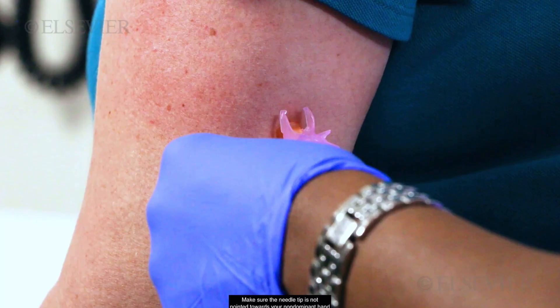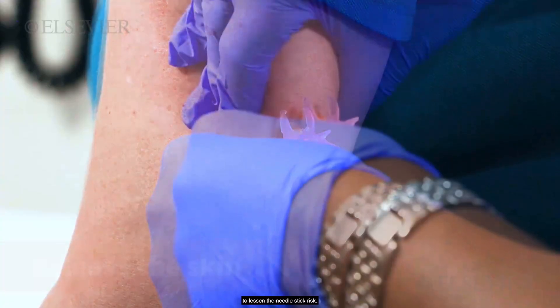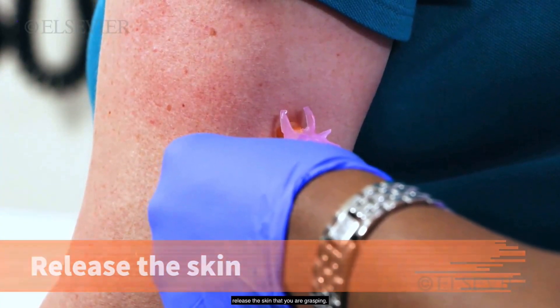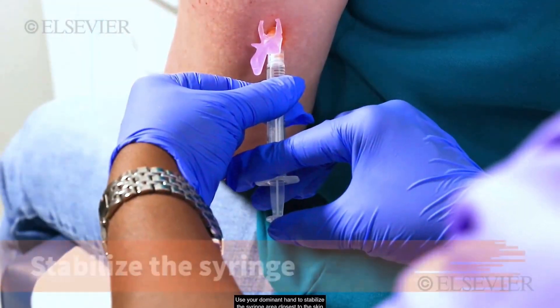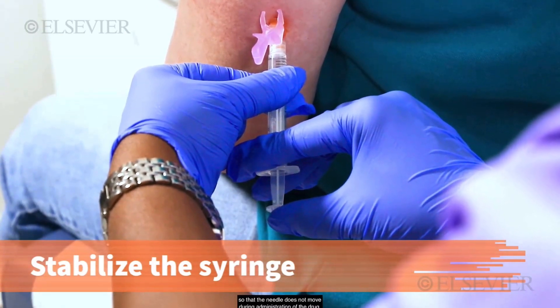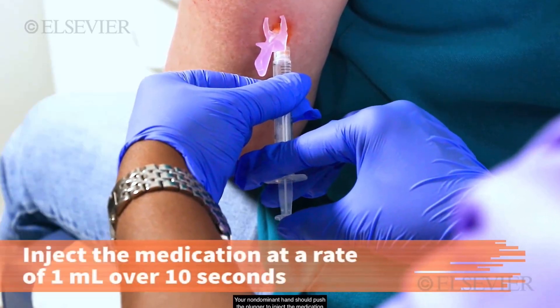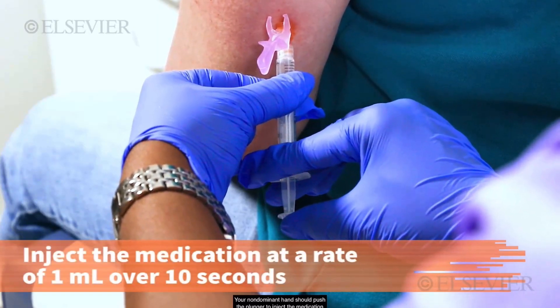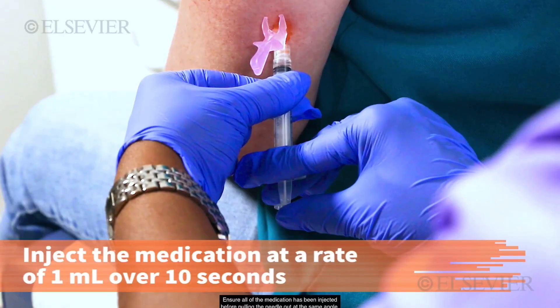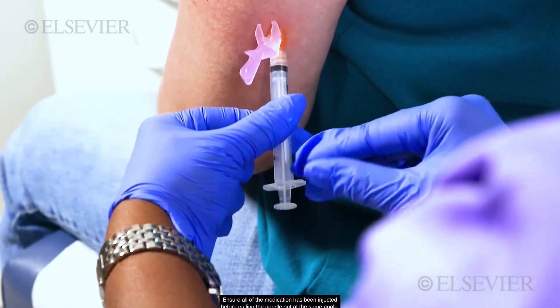Make sure the needle tip is not pointed towards your non-dominant hand to lessen the needle stick risk. After the needle has been completely inserted into the skin, release the skin that you are grasping. Use your dominant hand to stabilize the syringe area closest to the skin so that the needle does not move during administration of the drug. Your non-dominant hand should push the plunger to inject the medication at a rate of 1 milliliter over 10 seconds. Ensure all of the medication has been injected before pulling the needle out at the same angle.